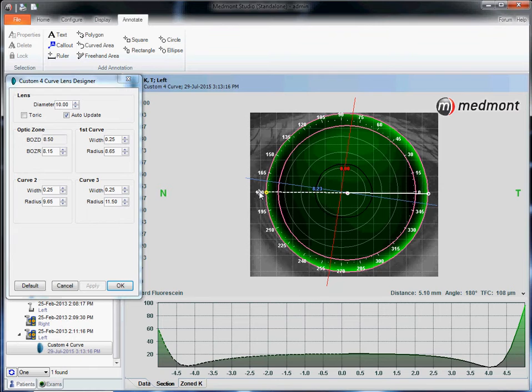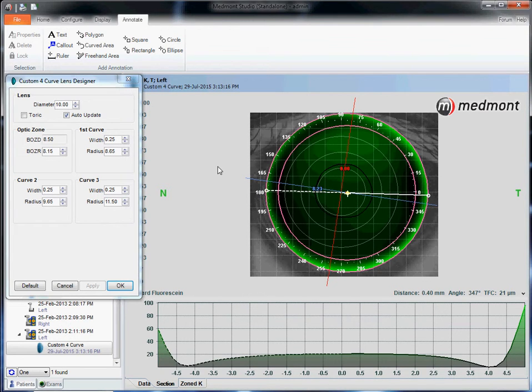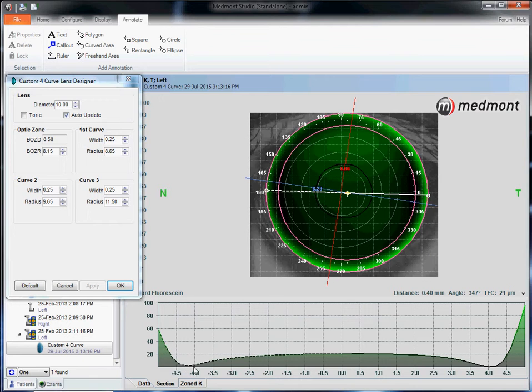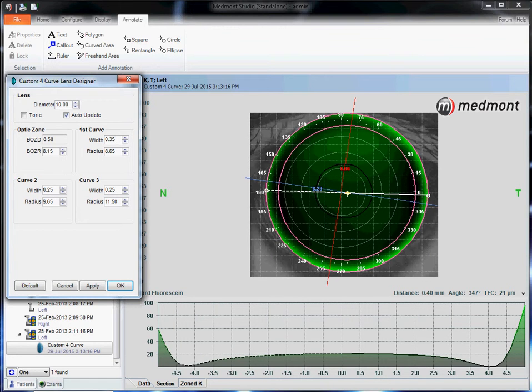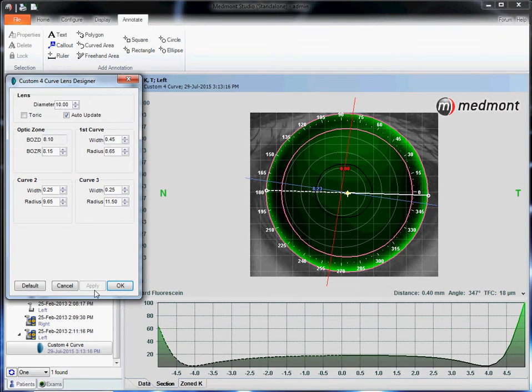Now we've got the right base curve to cornea relationship. The other thing we can do is vary the optic zone size by varying the peripheral curves if needed to change how that lens lands on the surface. As an example, if we were to reduce the optic zone size by widening out the peripheral curves, how would it change this landing when we click apply?